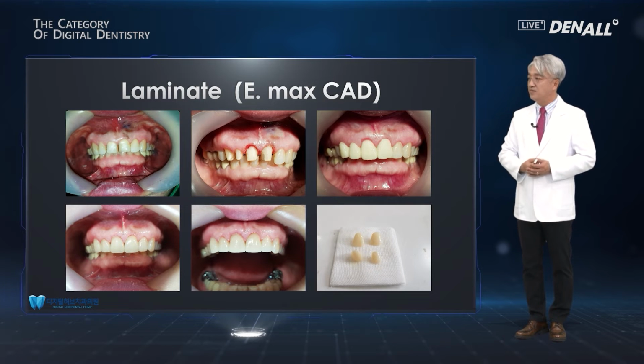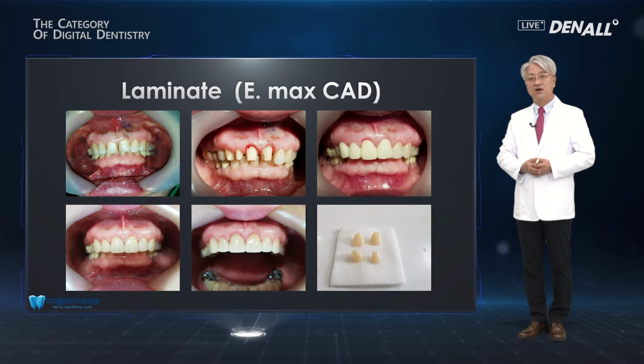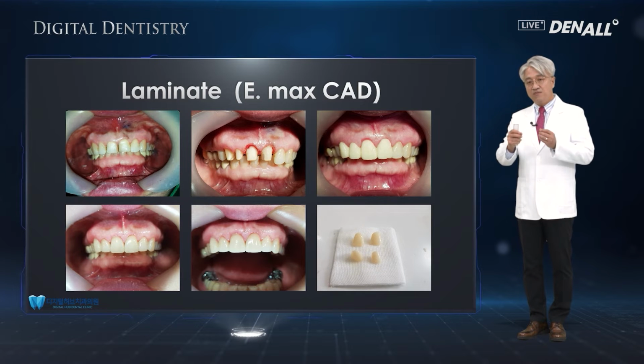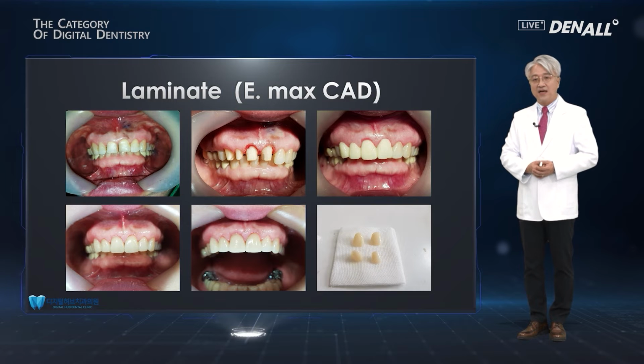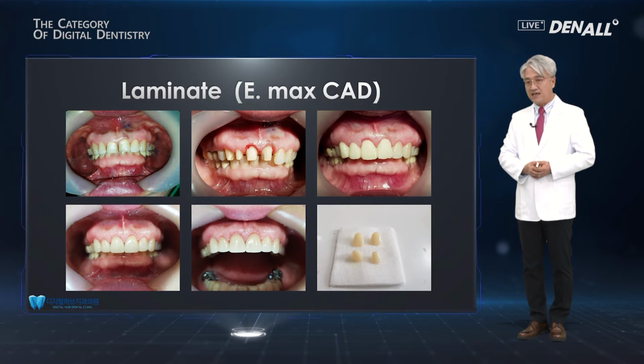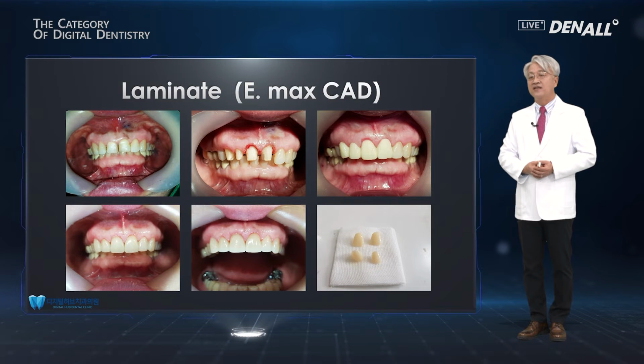Actually, all ceramic on the anterior side is aesthetic dentistry, so it requires skillful technicians, which means it required a lot of experience and skills. But thanks to CAD/CAM, in general dental clinics, this type of very satisfactory result can now be obtained. So if you become used to using digital dentistry, I believe in your clinic this level of high quality anterior aesthetic prosthesis treatment would also be possible.